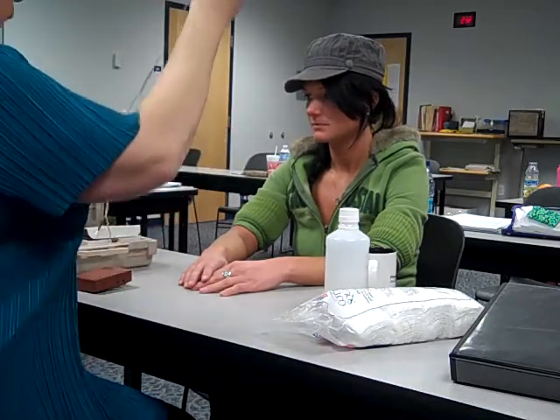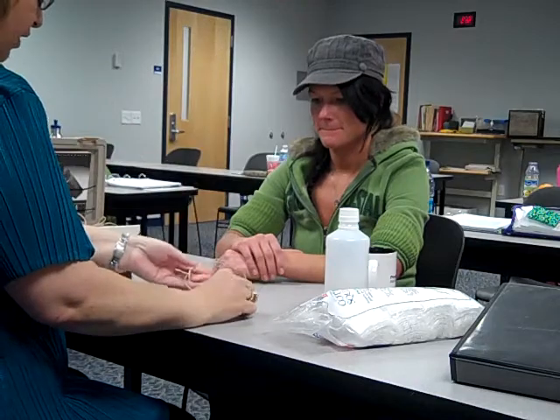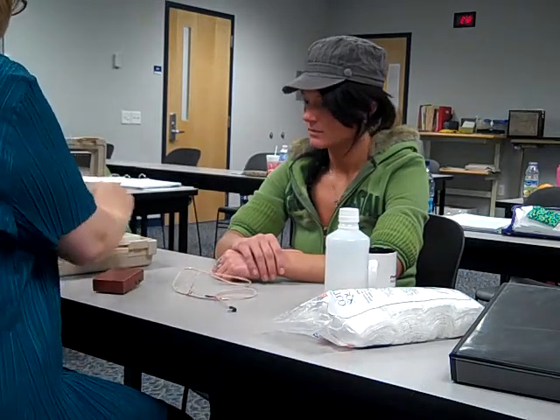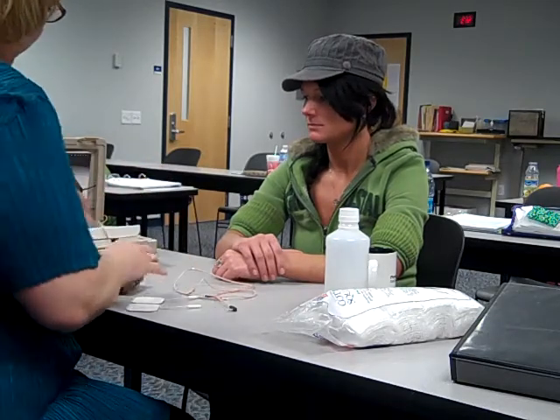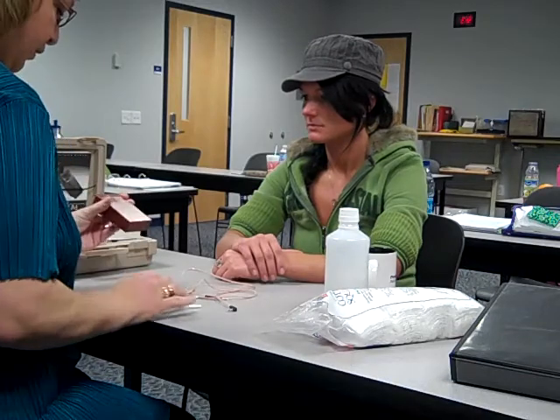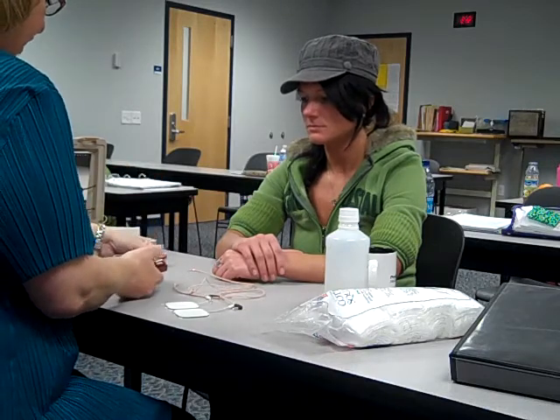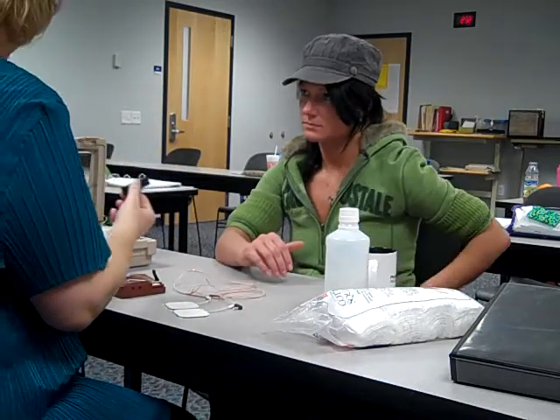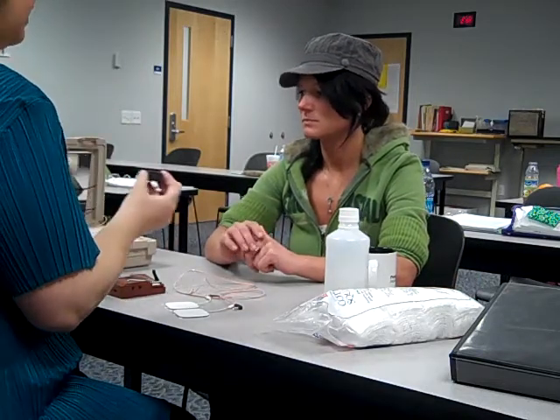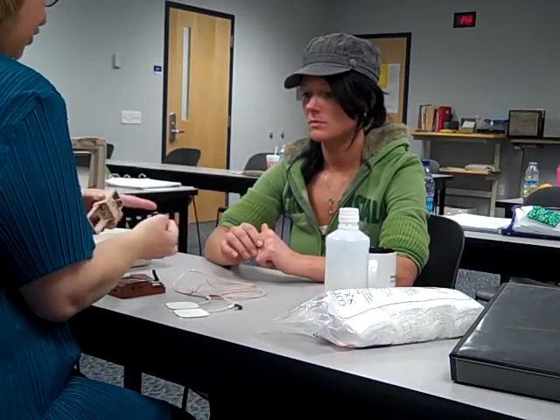Let me tell you a few things here. These are the lead wires, and we're going to plug those into the unit in a minute. We have two electrodes that we'll put on your forearm. Then the unit itself. On the back there's a little door that comes off and there's a battery in there — it's a nine volt battery. The unit will come with rechargeable batteries, usually two of them. They'll come charged up but once they die off, you'll need to recharge them.